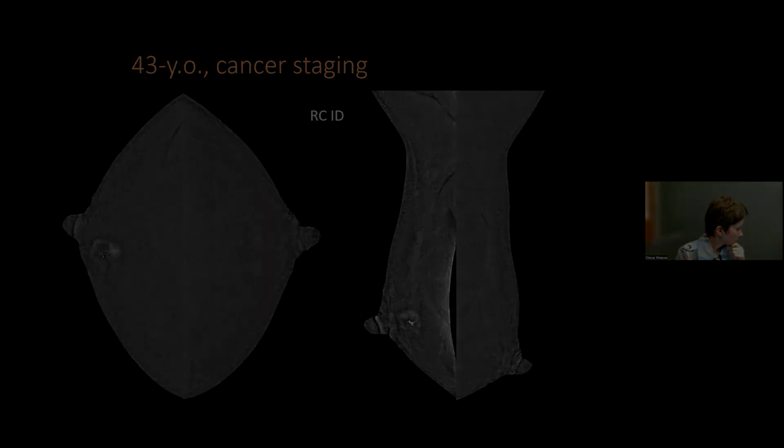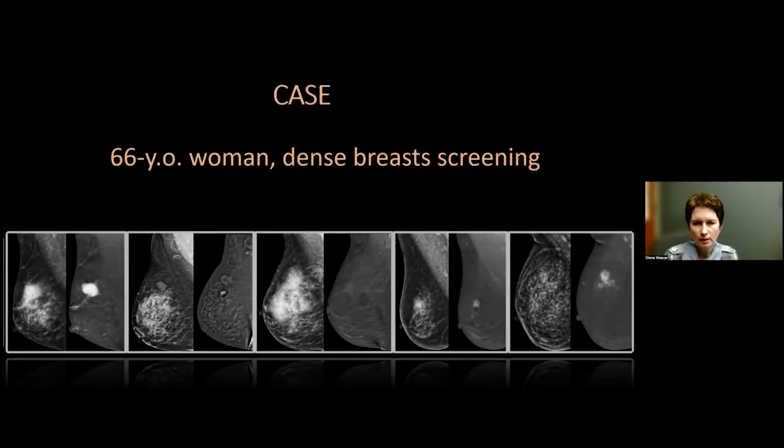This is a 66-year-old woman presented for dense breast screening. I just wanted to emphasize that screening is not yet among the approved indications for CEM. We have a research study here, although it is recommended as an alternative to screening breast MRI in those women who cannot have MRI for whatever reason.